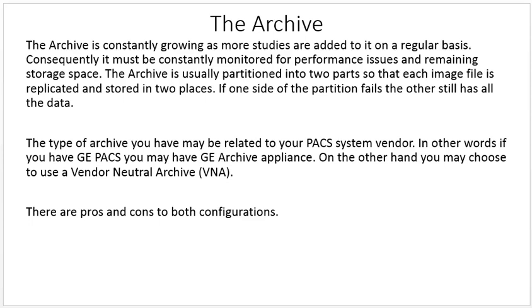configurations. So basically, if you have a GE PACS, you have a GE archive, and all of your images are stored in your GE archive. If you want to get your images out of your GE archive on a daily basis, the images will go in and go out, that's no problem. But if you want to take your images out and put them into a Fuji archive for your Fuji PACS system that you bought to replace your GE PACS system, GE is going to charge you a nickel a study or a dime a study, and that may add up. A dime a study times 5 million images is going to be a significant amount of money.